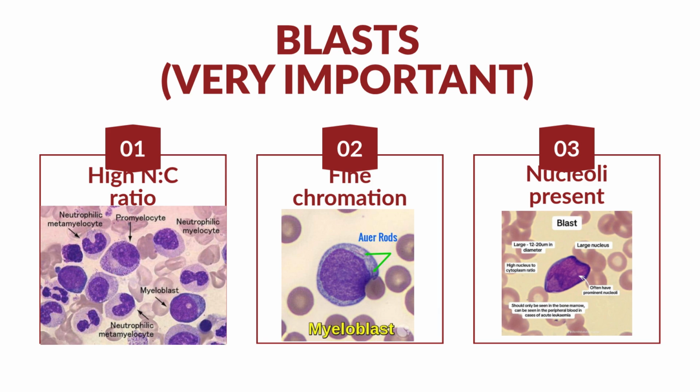You would want to call that a blast, but it's not, because it does not have that big old nucleus. It doesn't have that pretty blueness around the cytoplasm either. And look how the chromatin looks. It's totally different, so don't get them confused. Number 1 here is the myeloblast, and the promyelocyte over here is the second stage. Then you have this third stage, and we got a couple of them in here.